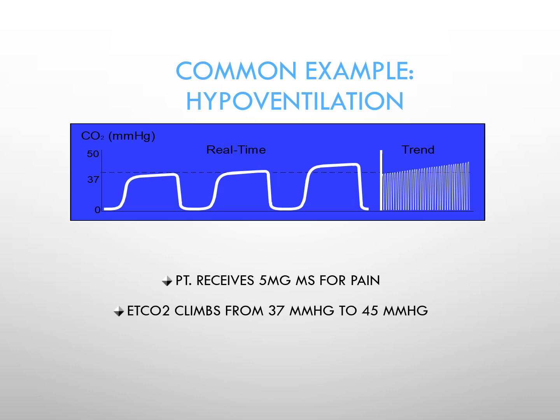And in those cases, it could be illicit drug use. You read and hear about that, but it could be prescribed. It's very intentional, but we want to monitor the patient to make sure that whatever we've given them for sedation hasn't knocked out their respiratory drive, or suppressed it sufficiently where the end-tidal CO2 or the PaCO2 is excessively high for the patient, causing an acidosis as some sort of danger to the patient.